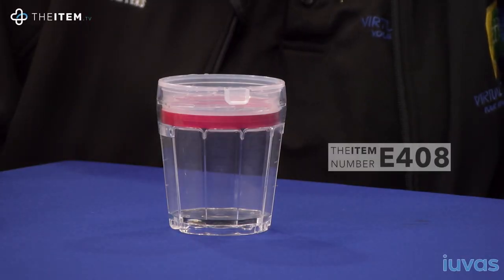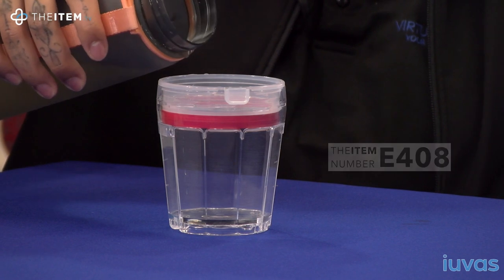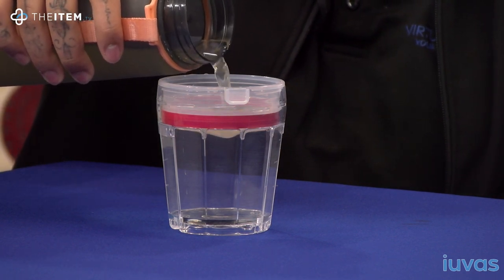Item number E408, the Sipper Cup. If you have dysphagia or any other related swallowing disorders, the safest way to drink would be in a chin-down position to protect your airways.